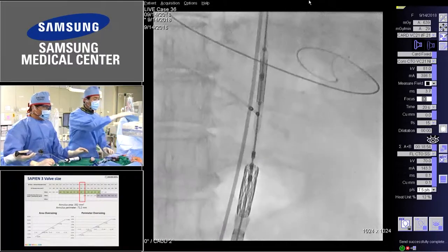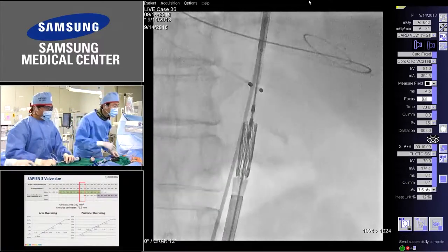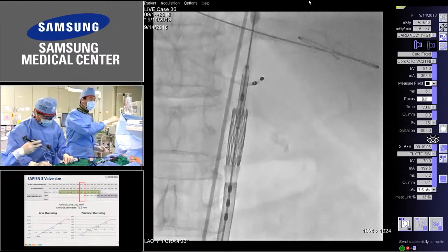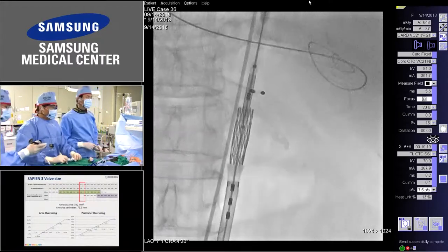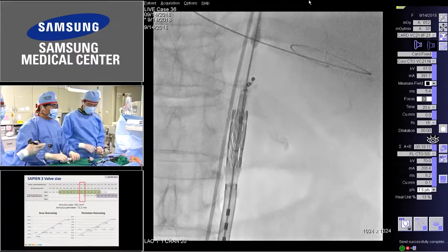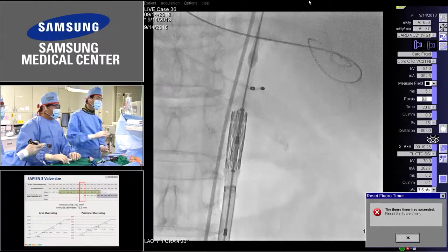We want to see the region. We want to protect the left coronary by guide wire? Okay. Actually, we discussed the protection of the right coronary rather than the left coronary because there was a calcium in front of the right coronary artery, very close to the right coronary artery.